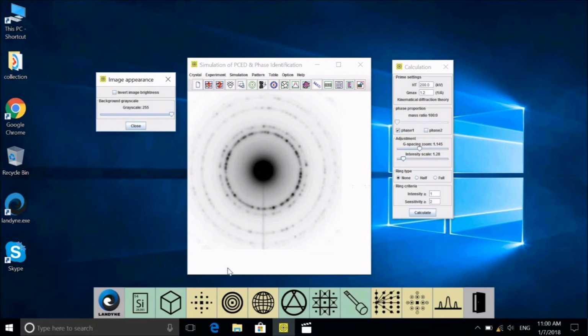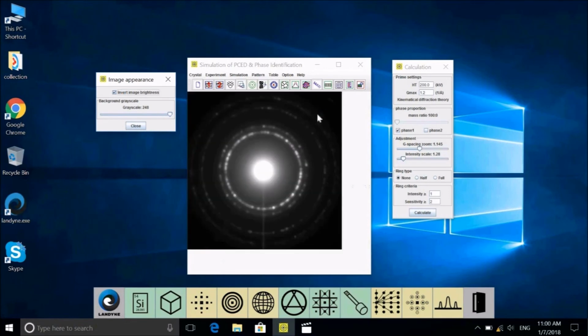If you can see here it is also more bright, so you can reduce the grayscale a little bit, to make the extra side match with your image. Suppose you load the image with a black background, and you can also match the side so it is more clear.